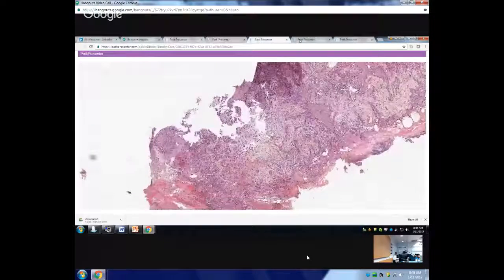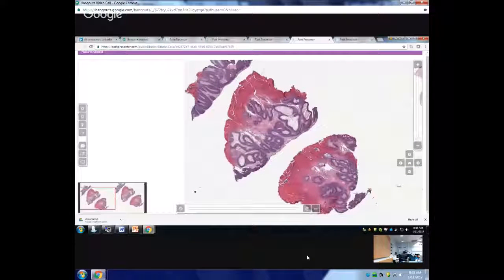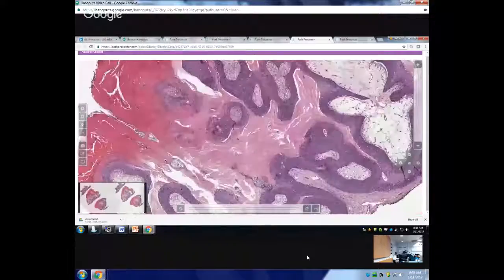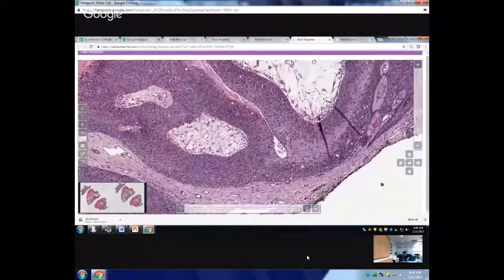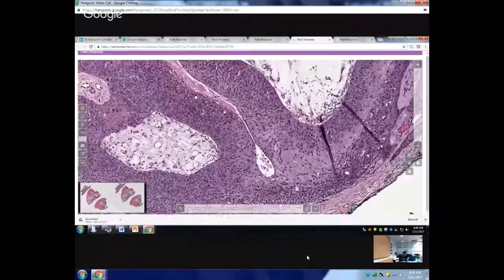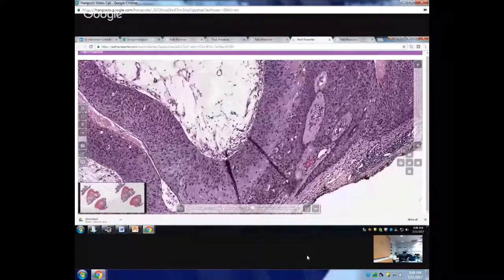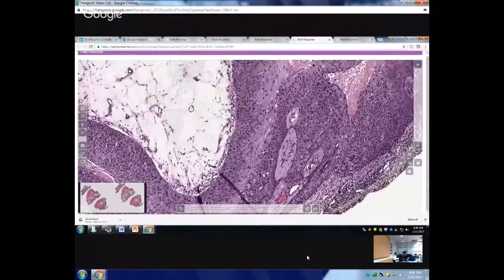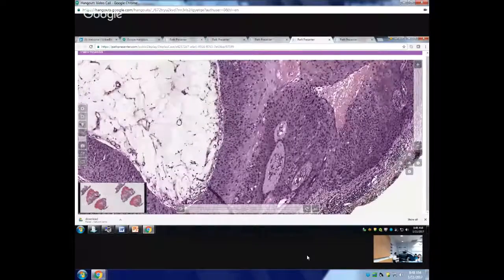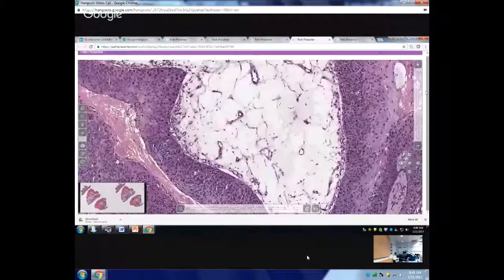Will the treatment be different? This is a more aggressive neoplasm, so you have to treat it more aggressively. The porocarcinoma. People have died because of porocarcinoma, and this can metastasize more commonly than a squamous cell carcinoma. And there are no stains. The only stain that can help you out is a CEA. If you do a CEA, the porocarcinoma is going to show you a lot of admixed ducts, which are not going to be present in the squamous cell carcinoma.